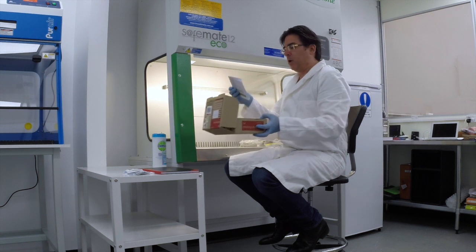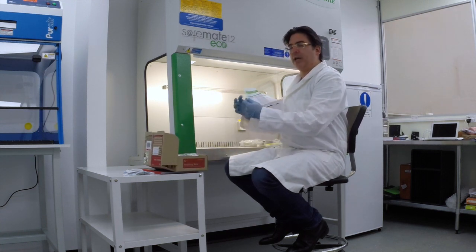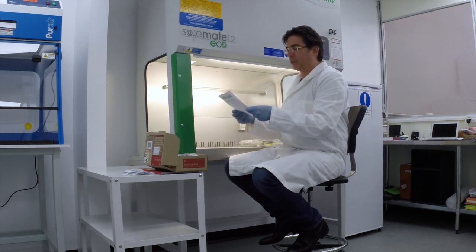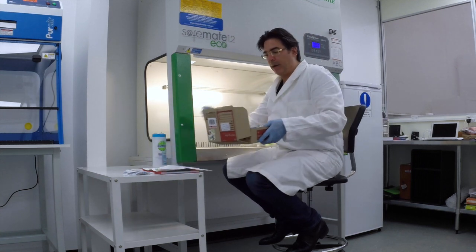I open the box, obviously I'm looking for the chain of custody form. I can see that this particular person has sent me back air samples and surface samples for two bedrooms, a bathroom and a living room. So this is particularly important information for us.